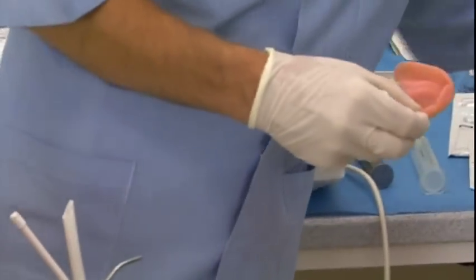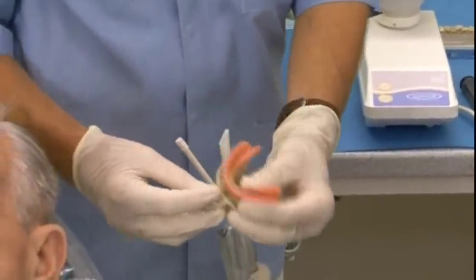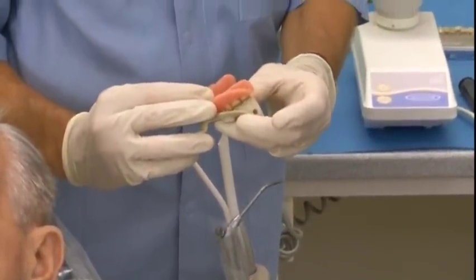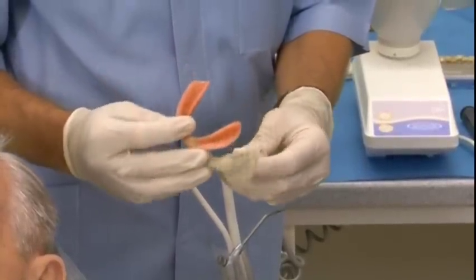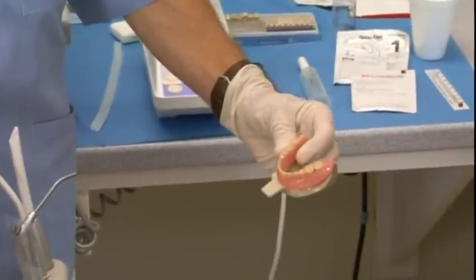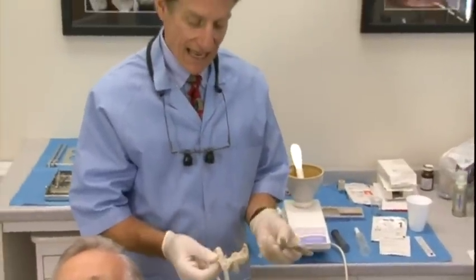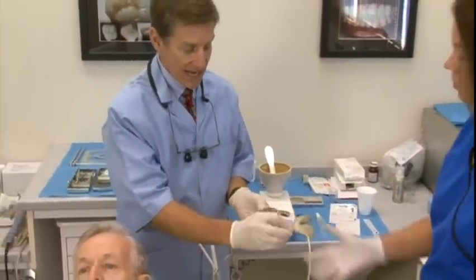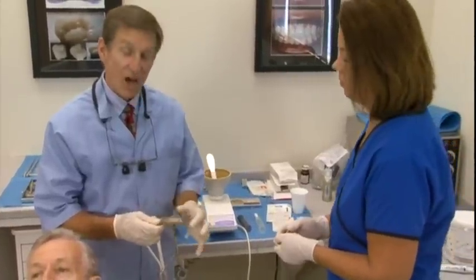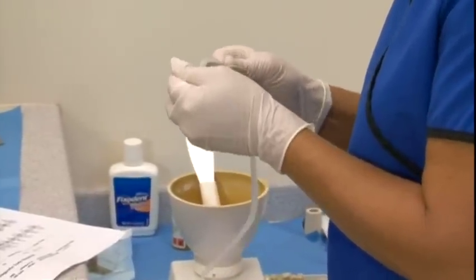We want it overextended. His lower denture is going to fit in that tray — it's about the same size. We're going to pick up a little more on the distal or the retromolar pad area. Knowing we've got a fairly accurate tray size, I'm going to ask Kathy to put some rope wax or utility wax all the way around the trays, then I'll try my tray in Mr. Bothy's mouth.